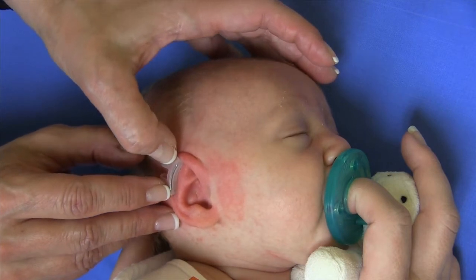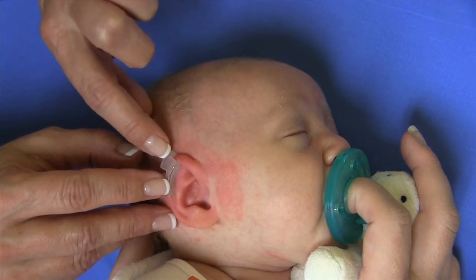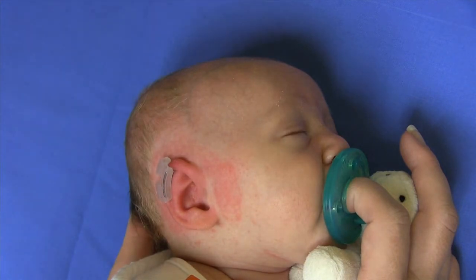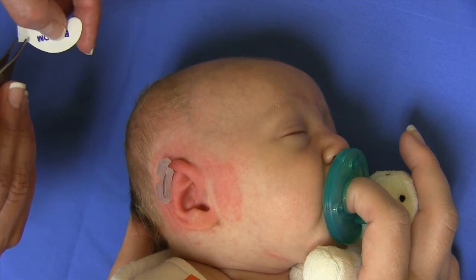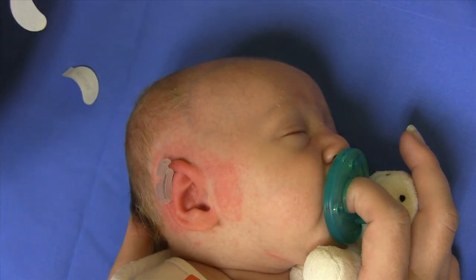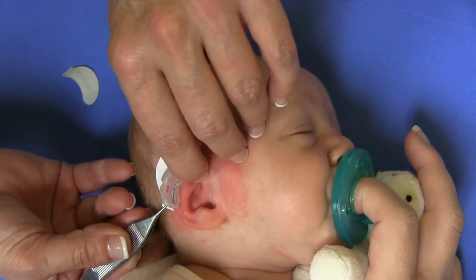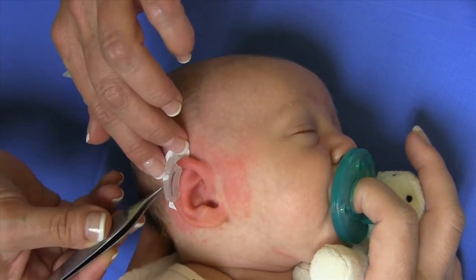You can see a little bit of lift there, and we hold that in place for another couple of weeks. You never want to put these down without having something underneath — that's what our base tapes are for. Now that I know where I want to place that, I'm going to take my bottom tape and place that underneath the retractor. I've peeled the one adhesive backing off and placed it right under there so the foot pads of that retractor sit right on top of it and not on her skin.